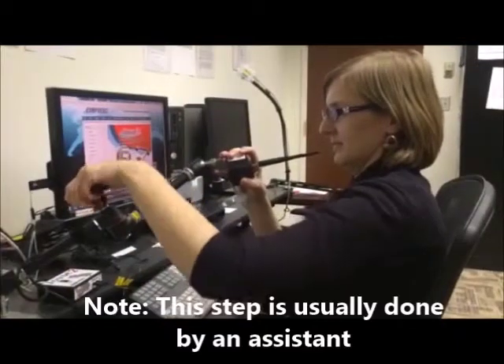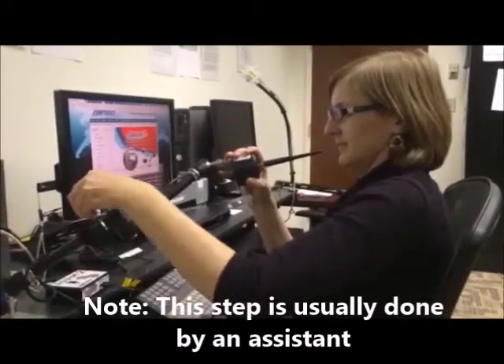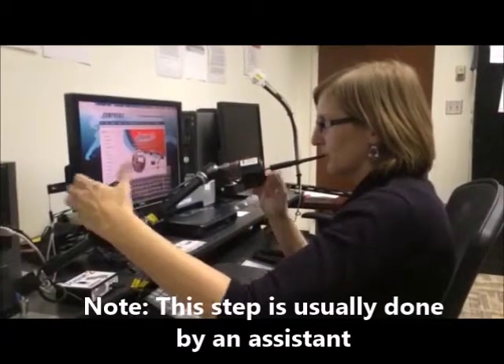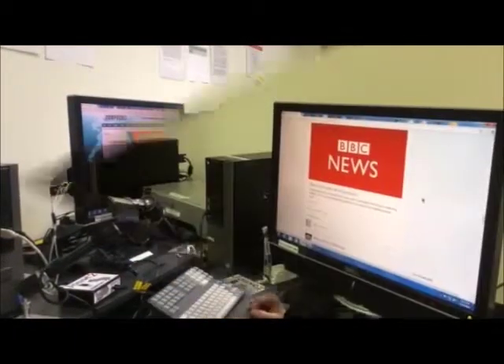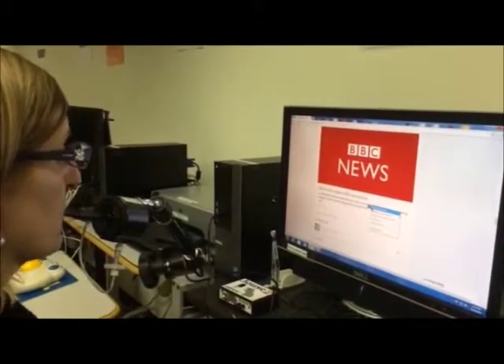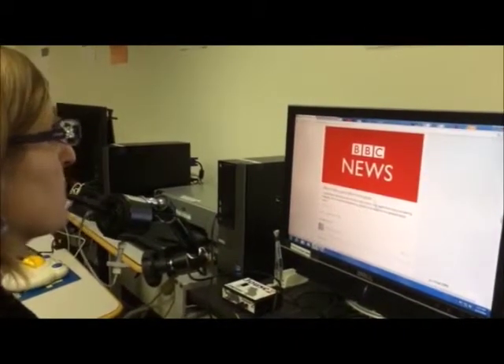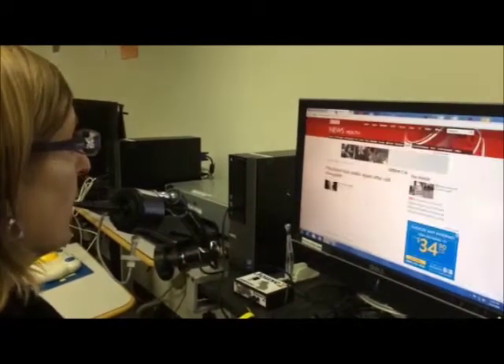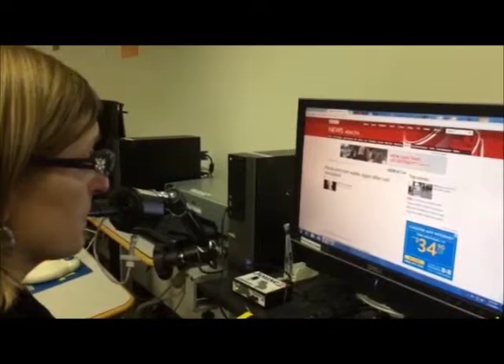To use the Joust 2, it is important to position the Sip and Puff mouthpiece at the appropriate level so it is accessible with minimal head movements. Once properly positioned, the mouthpiece can be moved like a joystick to control the movements of the computer mouse. It can be used for any computer function, from surfing the internet to typing in Microsoft Word using an on-screen keyboard.